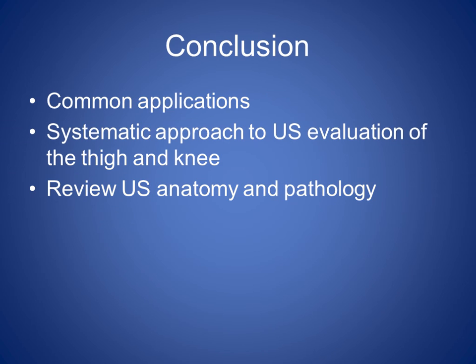In conclusion, we discussed some common applications of ultrasound. Remember, always have a systematic, organized approach to the thigh, so you know where you are and so you can accurately describe the anatomy. And we talked about some pathologic lesions.